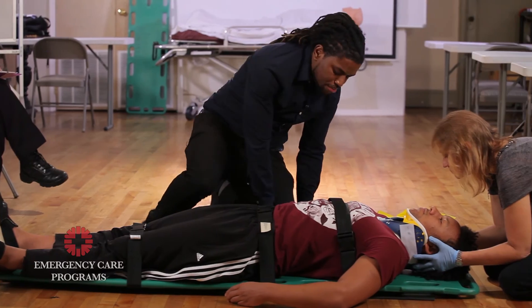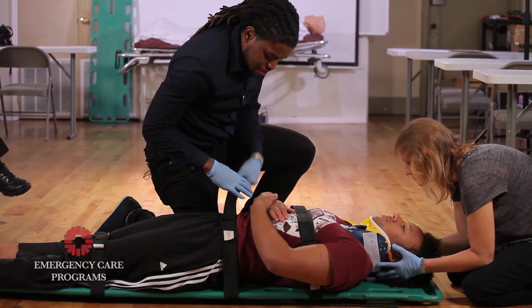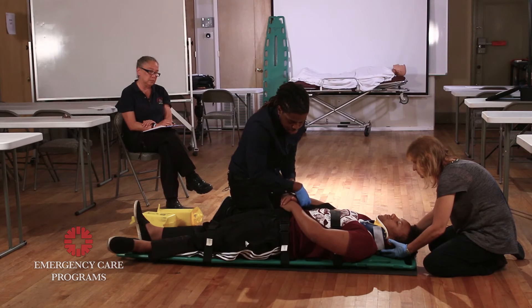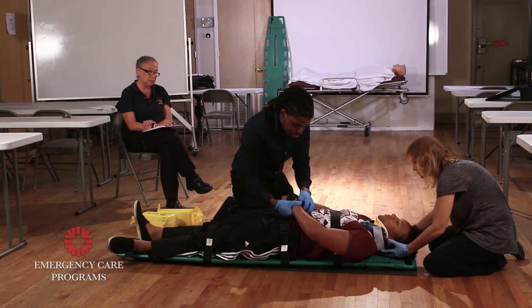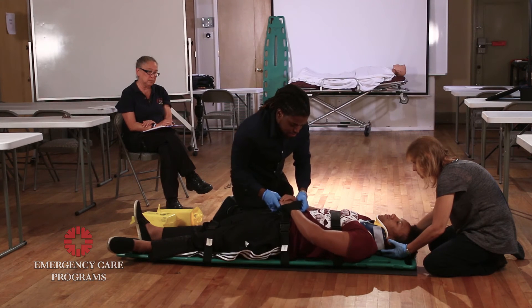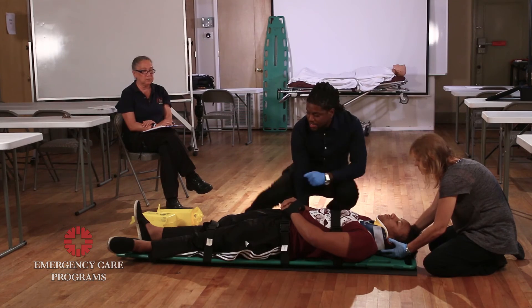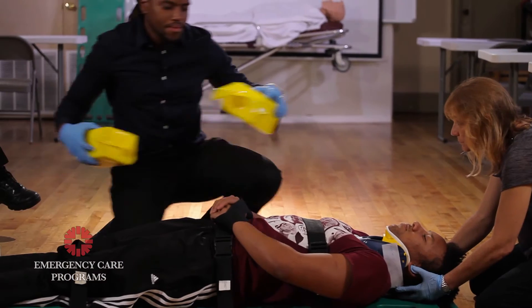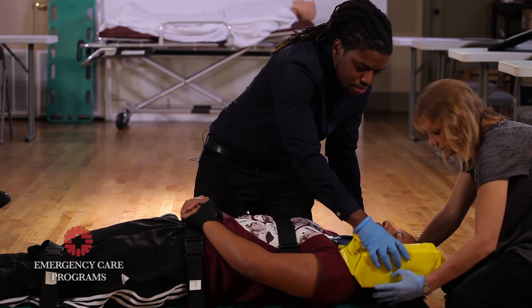Now I will secure his upper extremities. Please place your hands in the center of your chest for me, sir. And then lastly, I will secure the patient's head to the board. One, two.